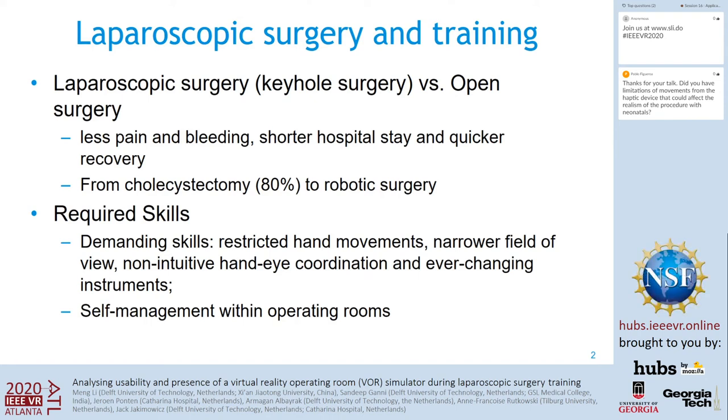Laparoscopic surgery requires different skills than open surgery. For example, it is operated under restricted hand movements, narrow field of view, non-intuitive hand-eye coordination, and ever-changing instruments. Within the operating room, there are different kinds of distractions, so the surgeons also need self-management throughout the procedure.